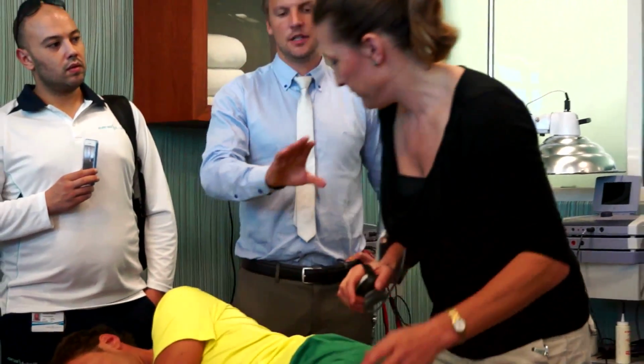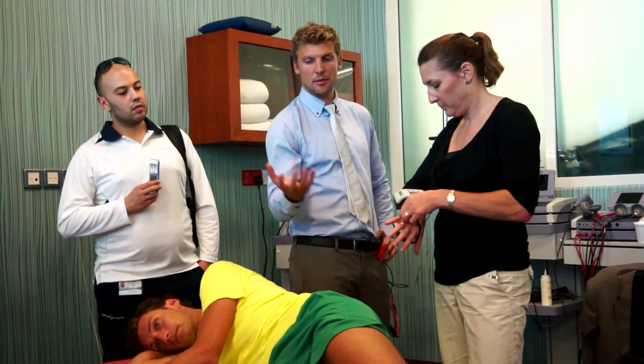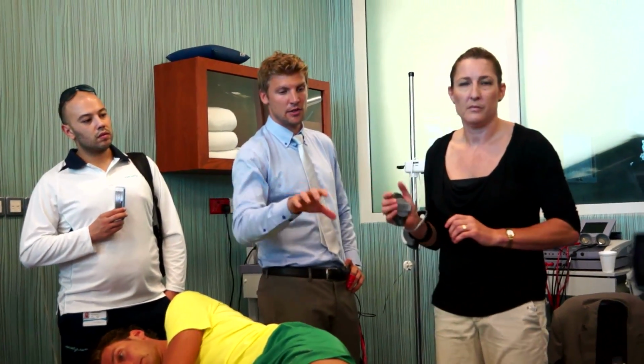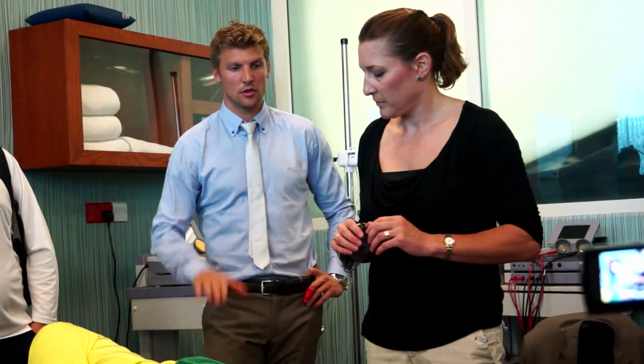You can use different dynamometers. What we like about this one is that you're able to have it in your hand, so you can correct the patient as you're pushing down as well. So you have a controlled feeling of the patient instead of other measures using two hands.